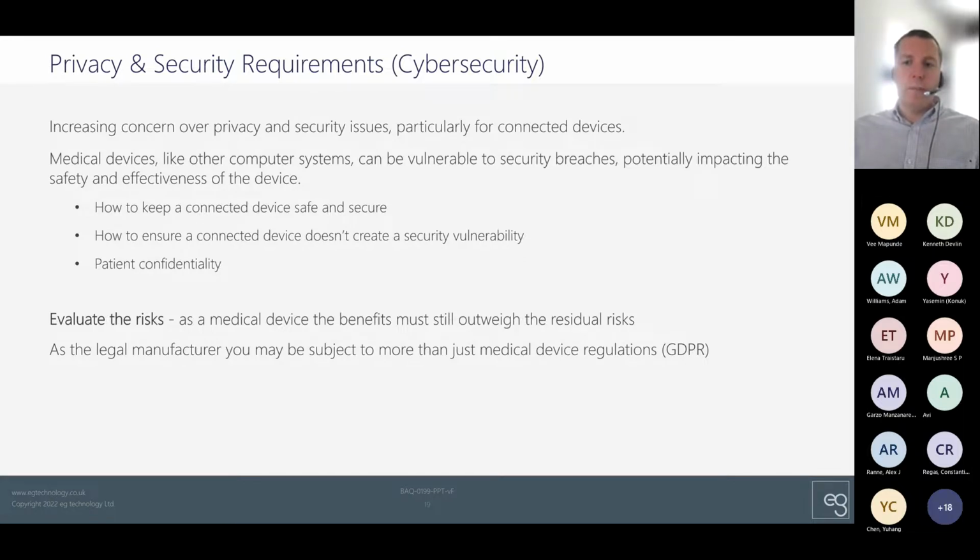It's also important to consider the practical aspects of software, which have broader support implications as well as implications for safety, because there might be multiple different versions in the field at any one time, or the software might need to run on multiple different platforms. In the NHS, this could also include legacy platforms. I suspect if you look hard enough, you'll find some Windows XP machines still around, Vista and Windows 7. Connected devices could also go many months without being connected, or perhaps end up being located in parts of the hospital with really poor coverage.